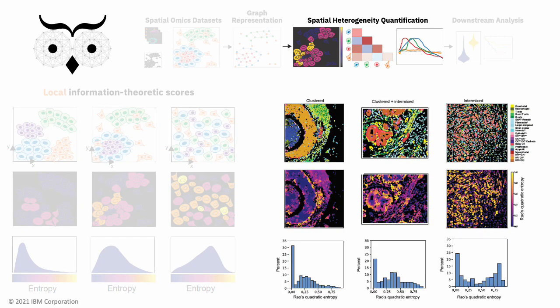And this is now also exemplified here with these 3 real-world cores. At the top, again, you see the different phenotypes, and then in the middle, you see each cell colored according to its entropy value, and the more yellow the color, the higher the entropy.